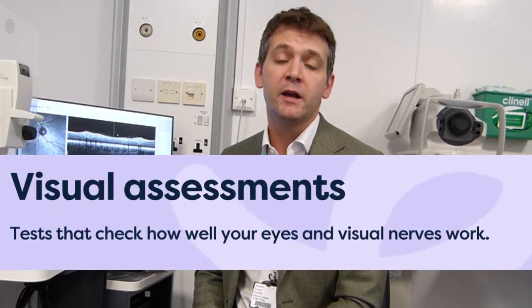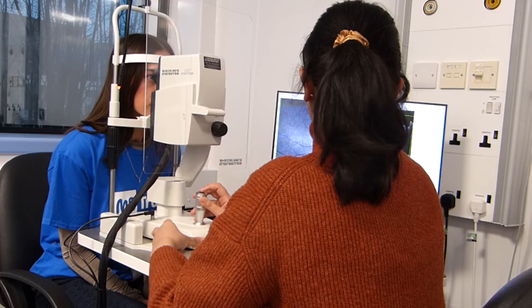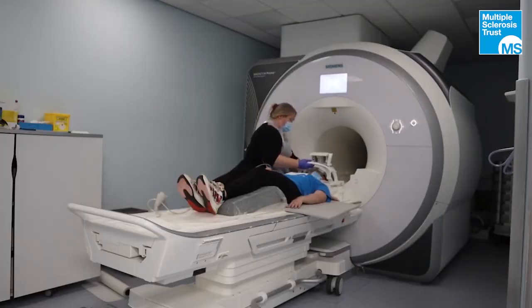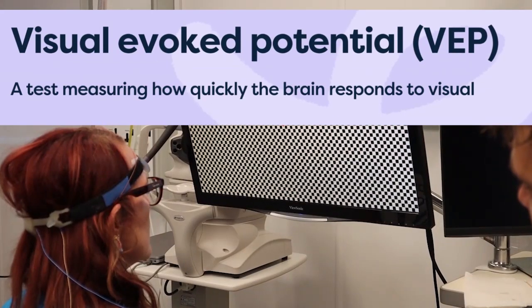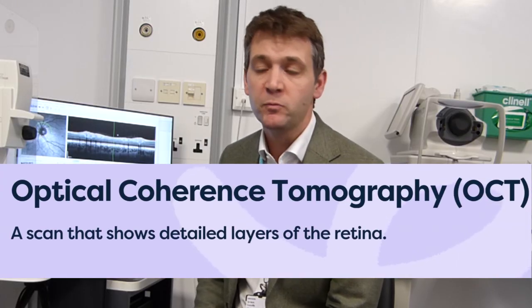And today we're going to talk a little bit about some of the visual assessments that are increasingly important in making the diagnosis of multiple sclerosis. The visual system is commonly affected over the course of someone's journey with multiple sclerosis, often at the earlier stages, but can become manifest at any point in the lifetime of someone living with MS. And we use various different mechanisms and methods to try and measure that. We can use MRI scans, we can use tests of visual function such as the visual evoked potential, or tests of nerve structure. And one of the main examples is Optical Coherence Tomography, or OCT.